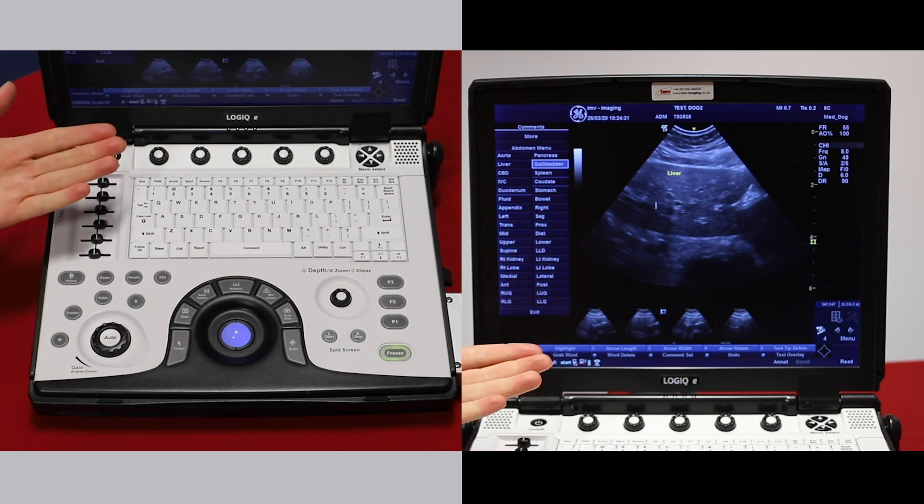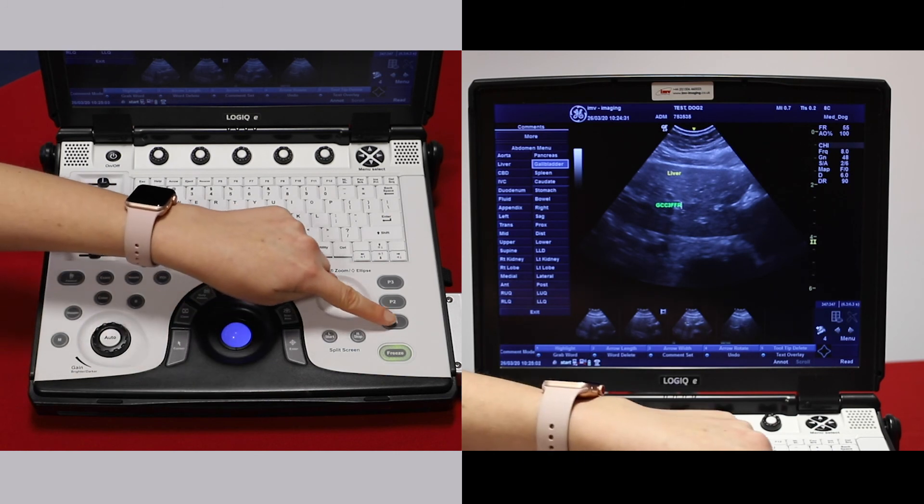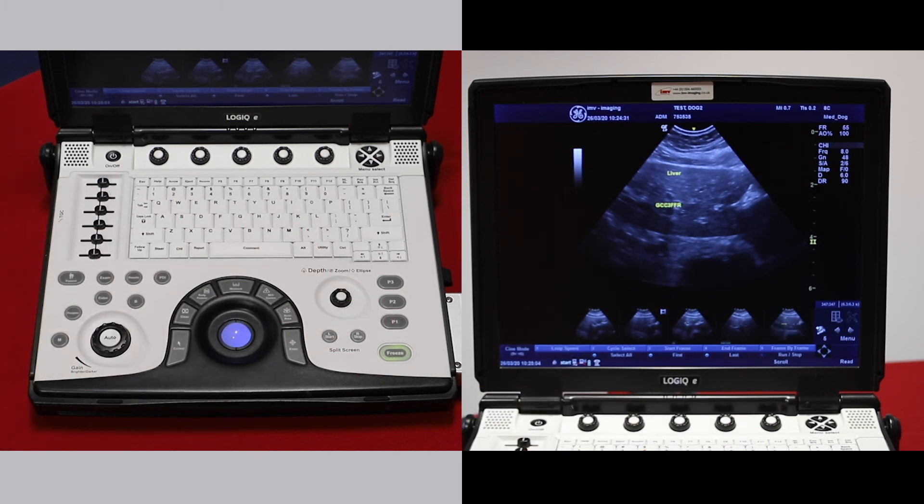Alternatively, once you've pressed comment, you can just start free typing. Again, press P1 to save, and that saves the image with the comments on it.